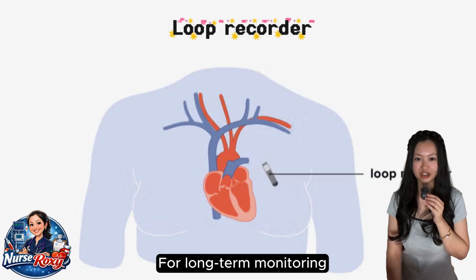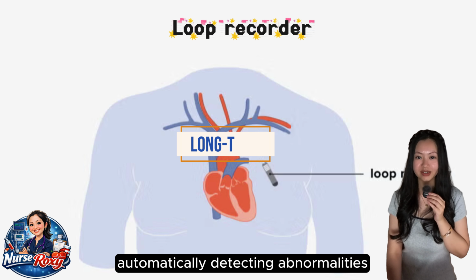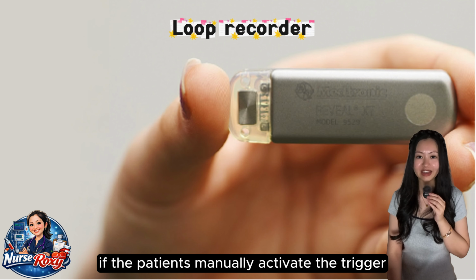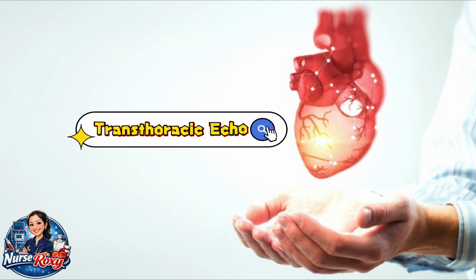For long-term monitoring, a small device can be implanted under the skin of the chest. It can track heart rhythms for up to 4 years, automatically detecting abnormalities or recording events if the patients manually activate the trigger if they are symptomatic.